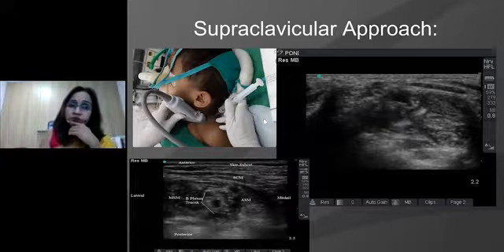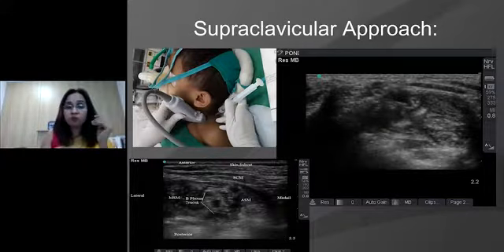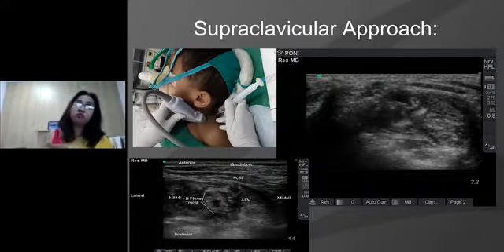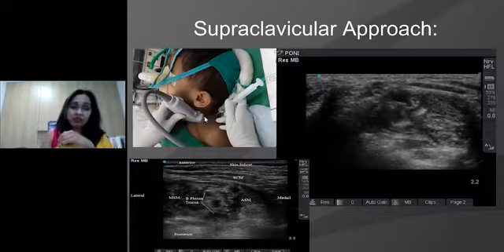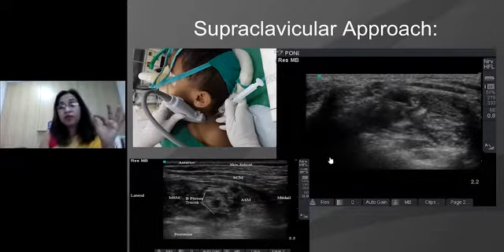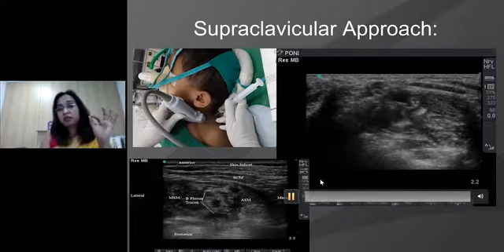Coming to the supraclavicular or subclavian perivascular approach, again, this is one important block. Yes, you can have most of the nerves of the brachial plexus worked on in this, and it has come in vogue, especially after the advent or application of ultrasound in this age group. So this probe is cleaned with Sterilium. Please do not put any alcohol solutions on the footprint. Cover it with a good sterile Tegaderm, and then this is how the block is done with an in-plane technique.